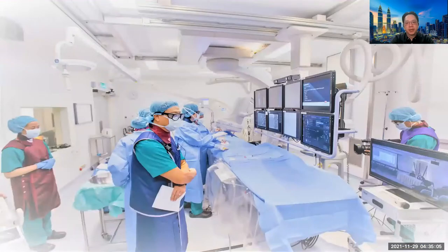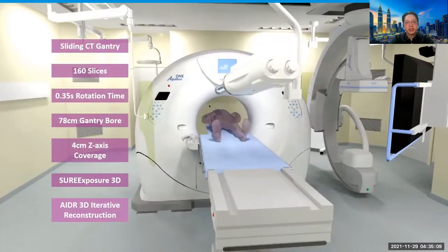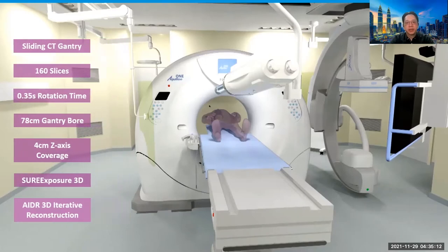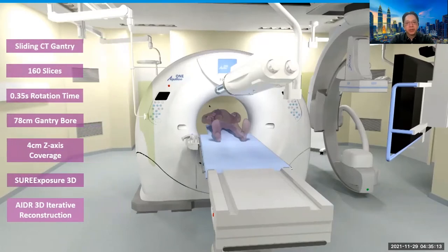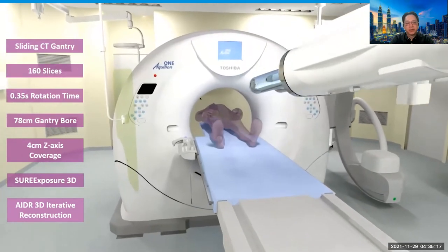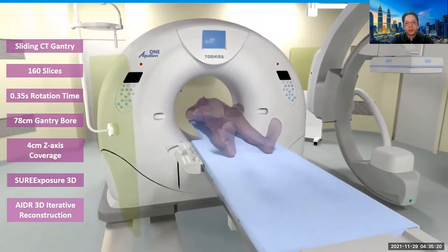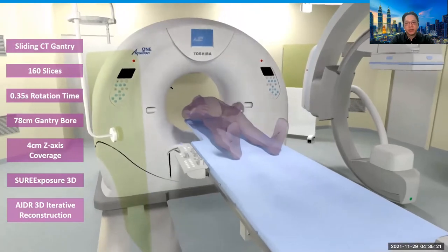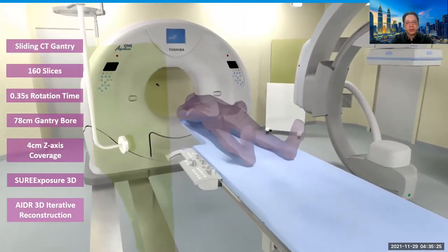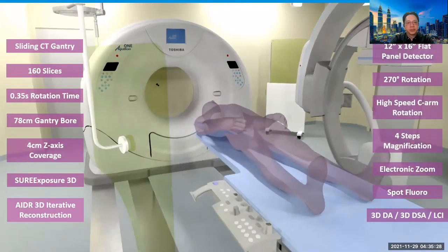This is my lab. We have a 160-slice MDCT mounted on a rail, sliding in and out of the area of interest with a floating tabletop, as well as an Angio CT arm which can swing in and out. With that, we are able to carry out all the combination therapy.